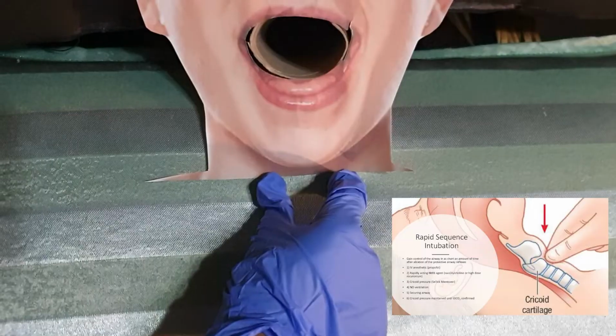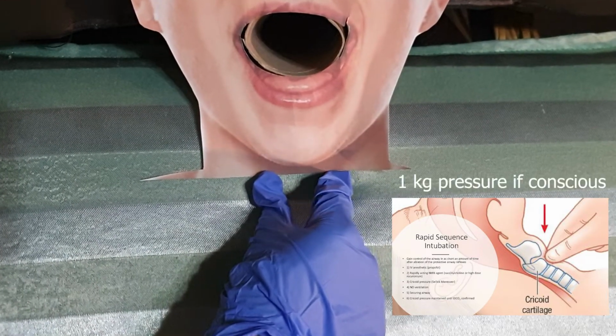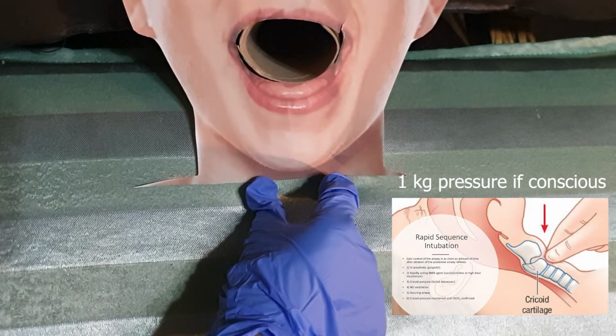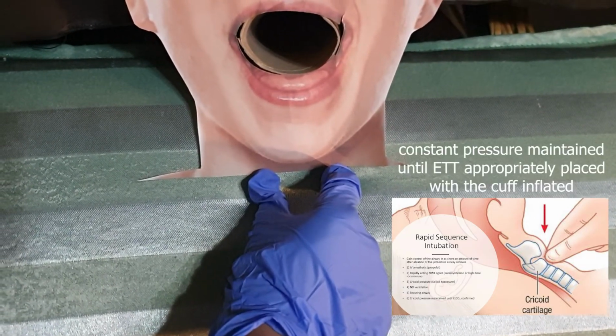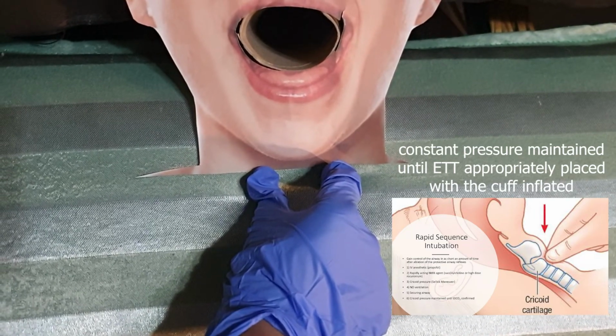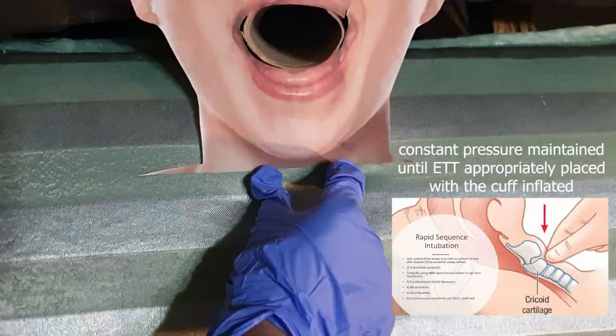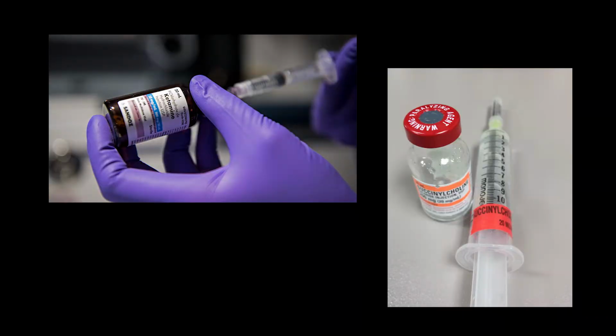a chin lift. Sellick's maneuver is done by external pressure, about 1 kg pressure at the cricoid ring against the vertebral bodies to occlude the esophagus. The constant pressure is maintained until the endotracheal tube is appropriately placed with the cuff inflated. Administer ketamine and then succinylcholine.